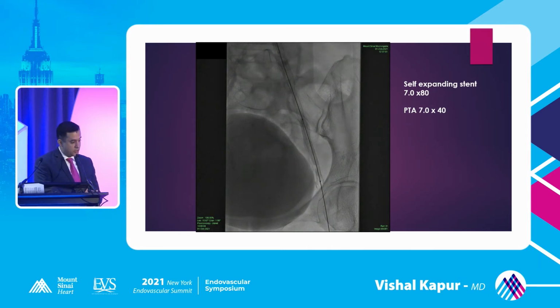But there's one issue you can see right here. If you look closely, you can see an outpouching coming up next to the iliac crest bone. I don't have a mouse to show, but I'm sure you can appreciate the iliac crest. You can see where the balloon is, and there's a small outpouching. That's the lateral aspect. Right, the lateral aspect. Hold on. Do we have this? No, I can see it. Right. So I guess that's a sign that you are going to get into trouble.